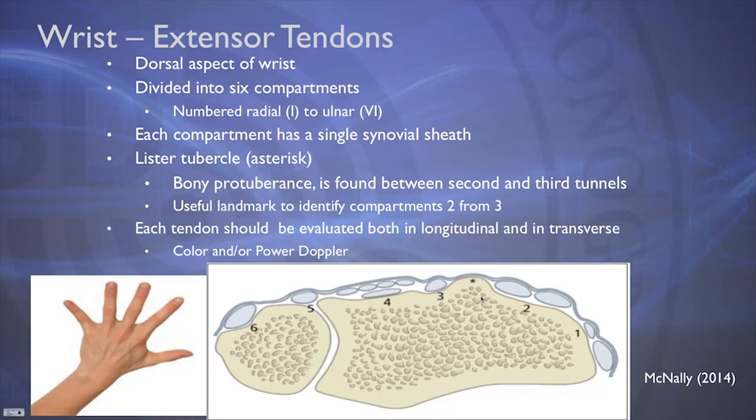Each tendon should be evaluated both in longitudinal and in transverse, and utilizing color and or power Doppler depending on what is indicated at your institution for any kind of hyperemic or inflammation changes.